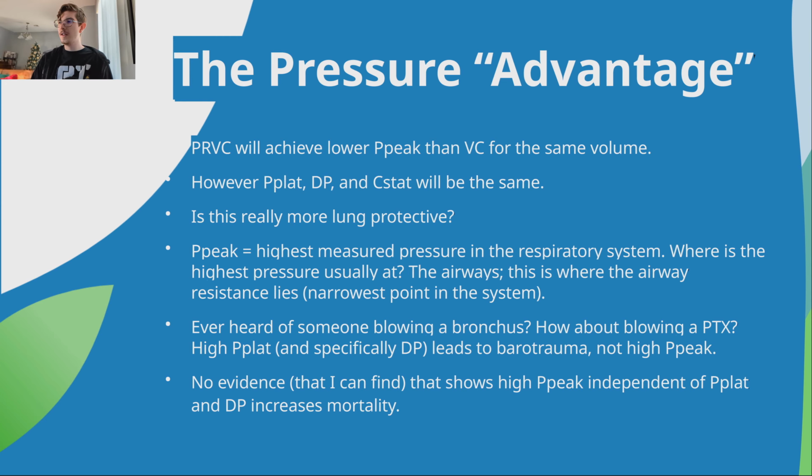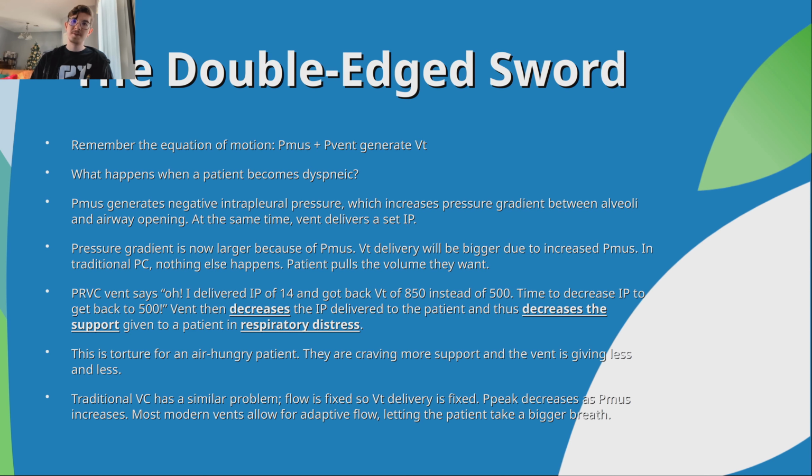The claim that PRVC leads to lower pressures for the same volume is very misleading. It is not false, but it is misleading, okay? And anyone that tells you that PRVC is more lung protective because it's giving the lowest possible pressure, I don't think they understand what lung protective actually means.